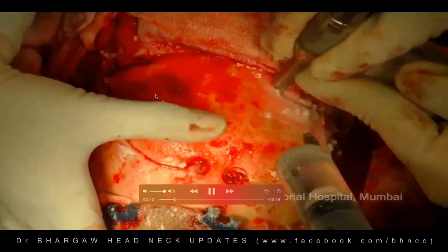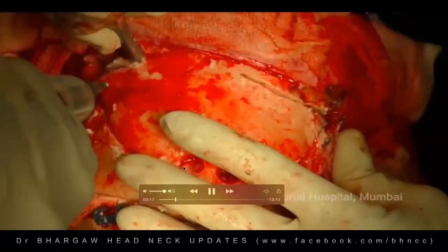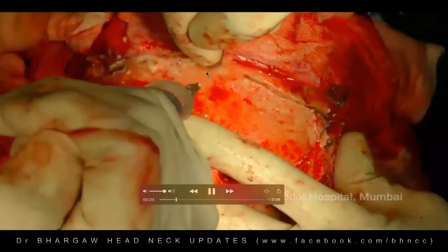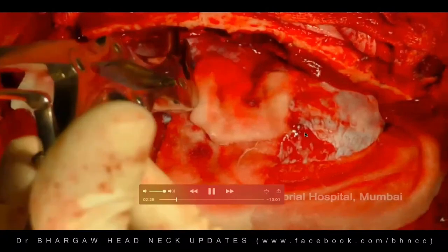And here again, when you're using this instrument, once you've done the burr hole, you have to dissect the dura away, so that as you're coming with this, you don't excise the entire dura there. That can happen, so you have to be careful. In this case, it has not happened.